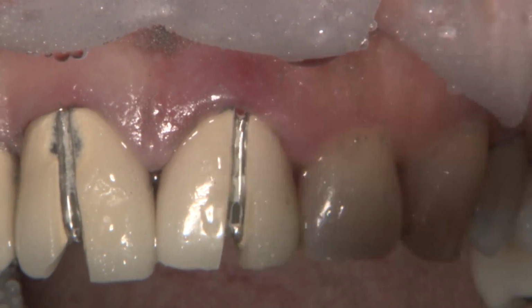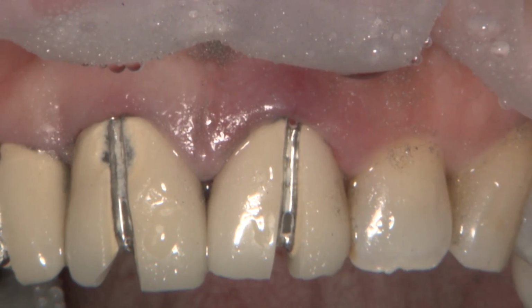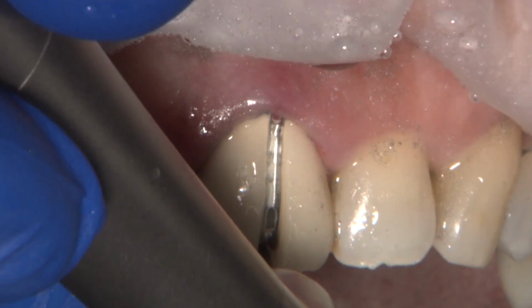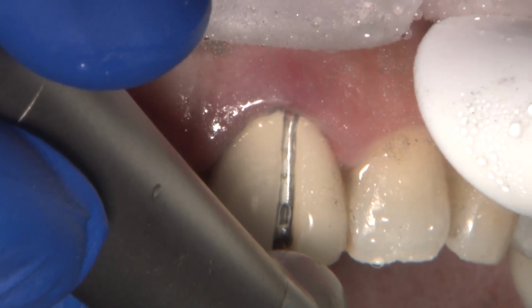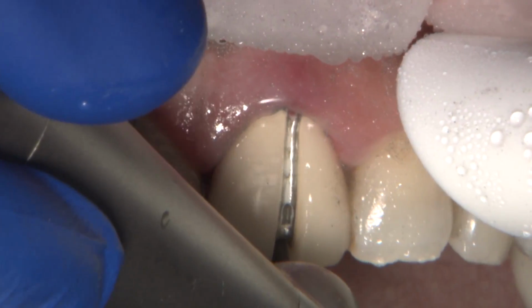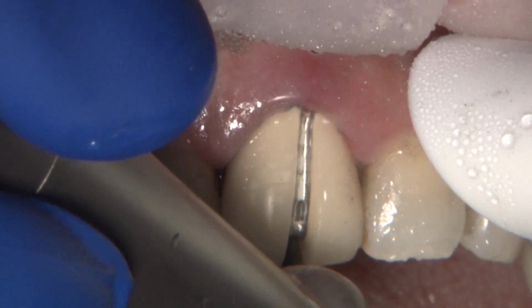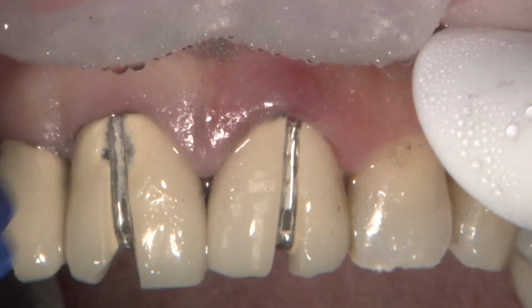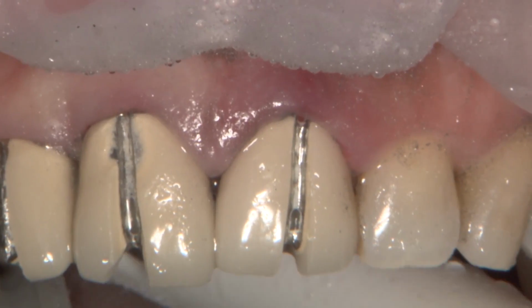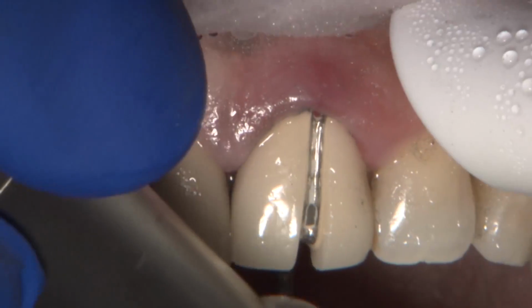There was no difficulty in cutting these crowns off. I could see clearly the cement interface, so no risk of damaging the tooth, but we can inadvertently damage the gingiva. You can use a retraction instrument and get the tissue out of the way, but I didn't here, and you will see I slightly nicked the gingiva on the facial of number 9. But in this case, I knew I needed to do a focused laser recontouring to bring the gingival architecture of number 9 in harmony with number 8.